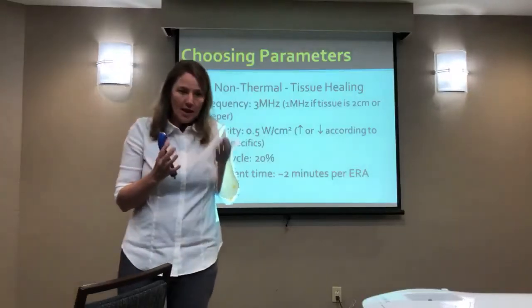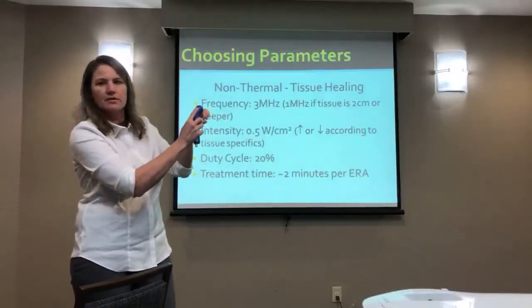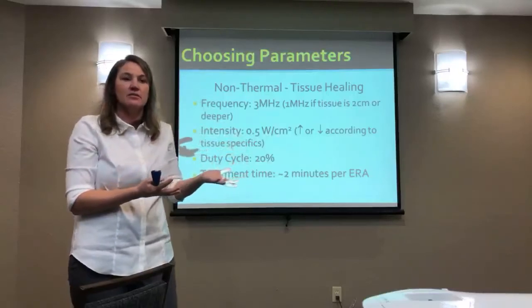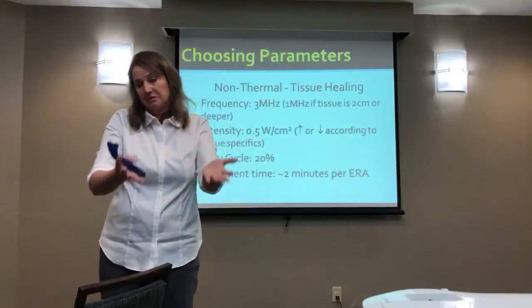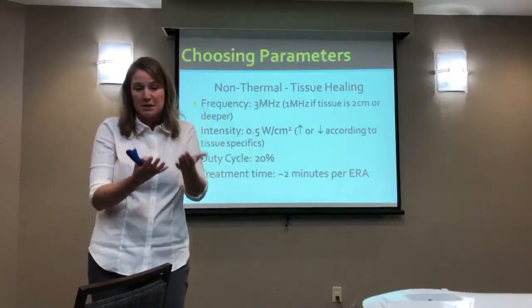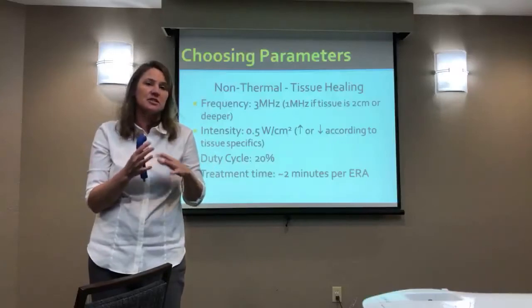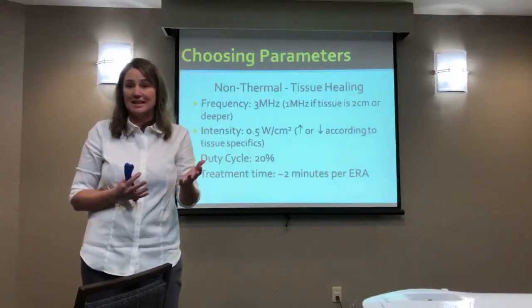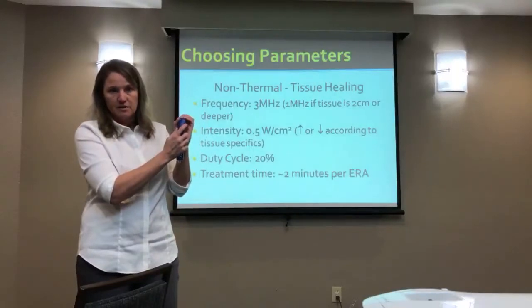Now, the way I came up with the plan is the idea that that is different than going around and around and around. The idea that you want to create some sort of a physiological cascade of events, that sounds fancy, right? So you want to stimulate the cells enough that you create some sort of event that it transmits. And I came up with this just based on what I've read, is the idea that maybe a lot of treatments that are being delivered are just not being done enough, that there's just not enough energy that it caused anything to happen. So that's a method I use, is 2 minutes over an area before I move on to the next area.